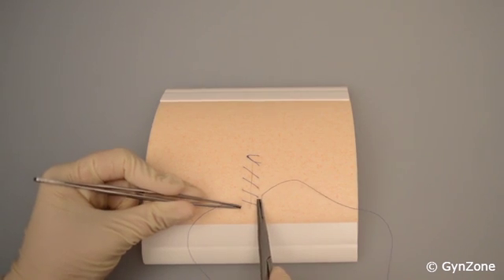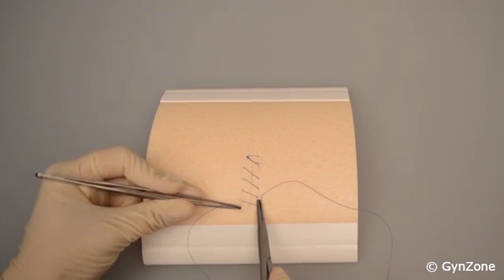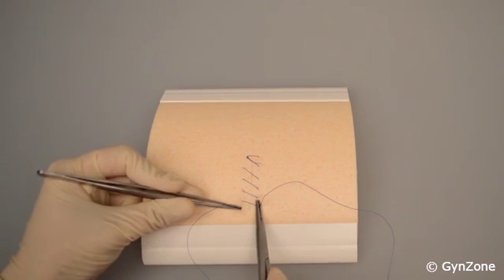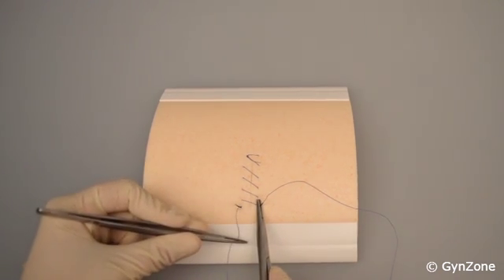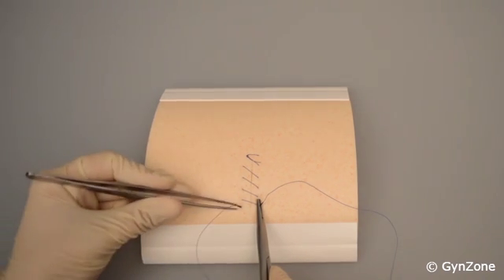You can point the dissecting forceps at the place where you want your needle to come up and apply a slight amount of counter pressure towards the tissue. This makes it easier for you to enable the needle to reach the right place.